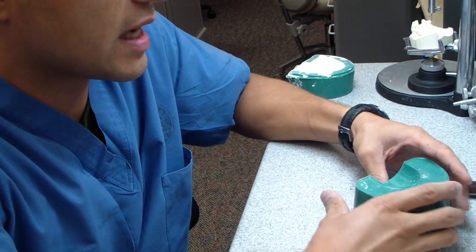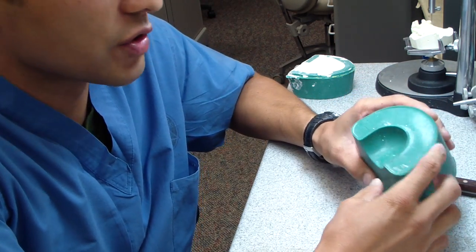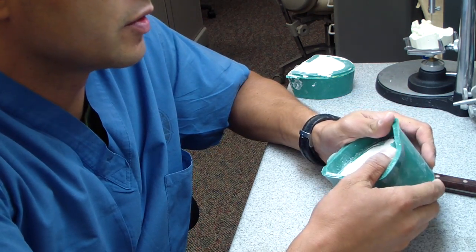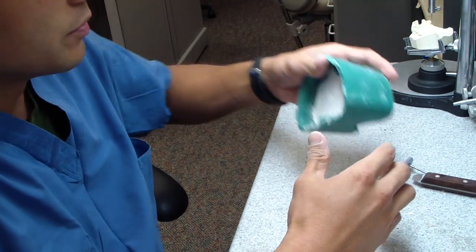show you. So the last time you saw this, I was just pouring up the polyvinyl siloxane. Remember, this is typically what we use here to duplicate casts.